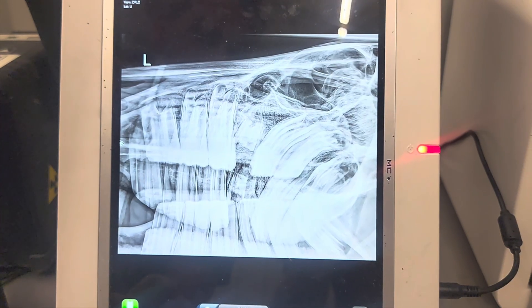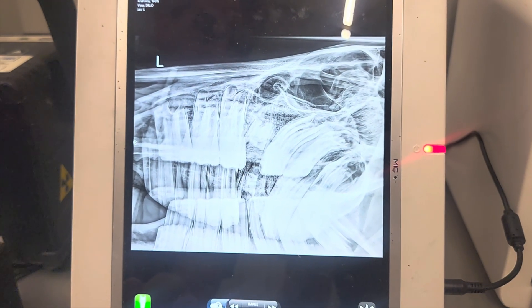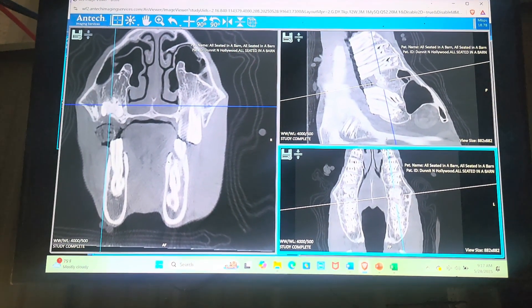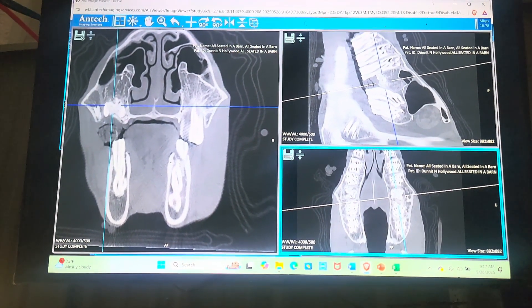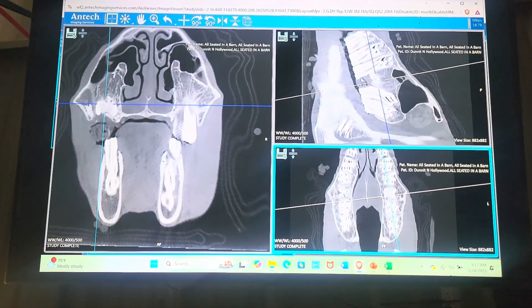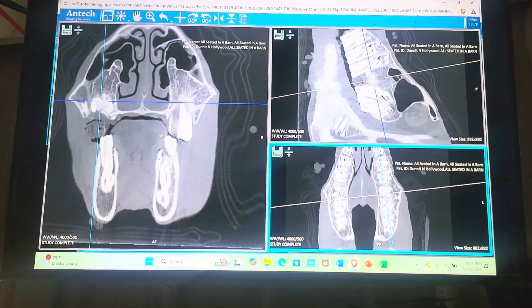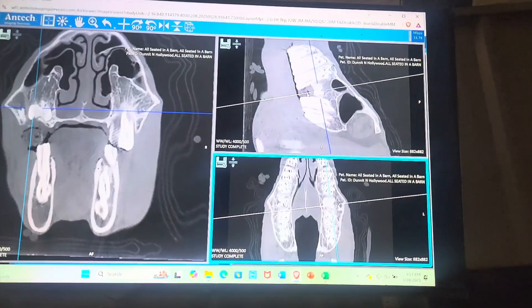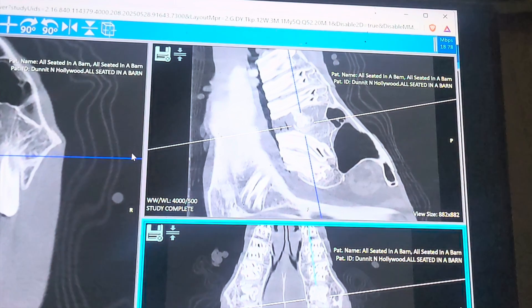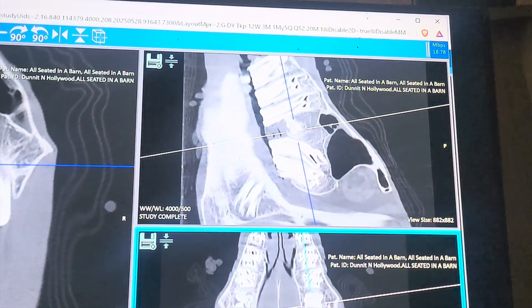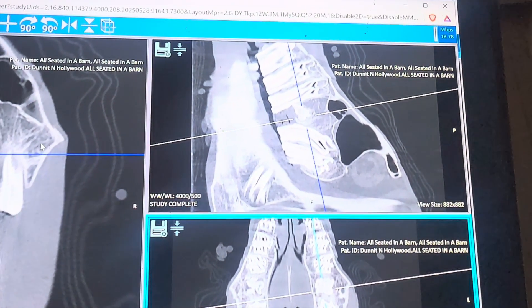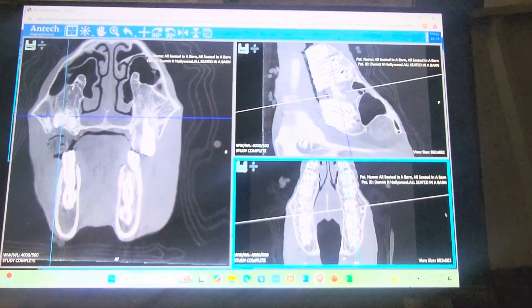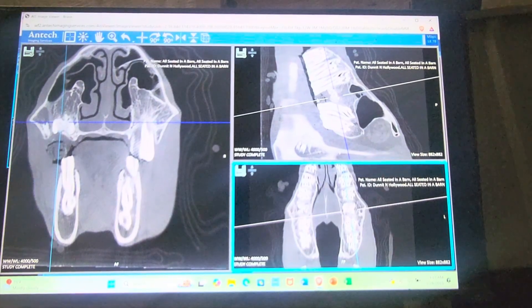Now we're looking at the CT scan. Here we have a horizontal view, this is a sagittal view, and then this is transverse. On the sagittal view, there's a little 'R' marker here, so this is the horse's right side. Where we're looking here is the horse's left side, and we can see the number 209 is here.